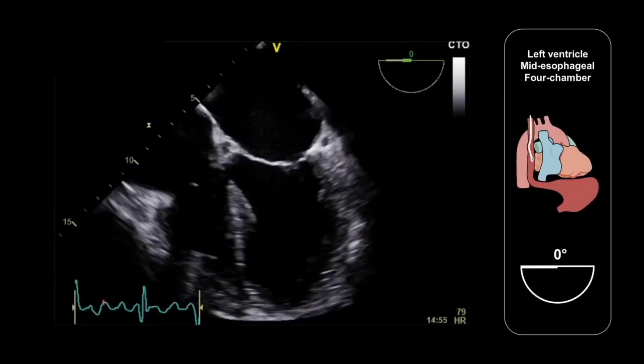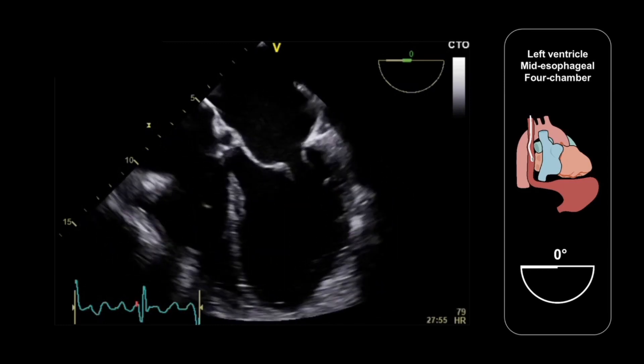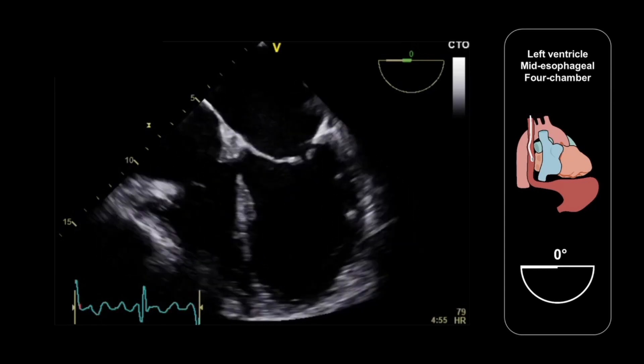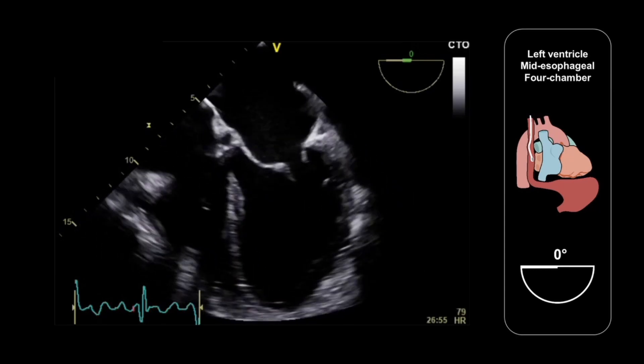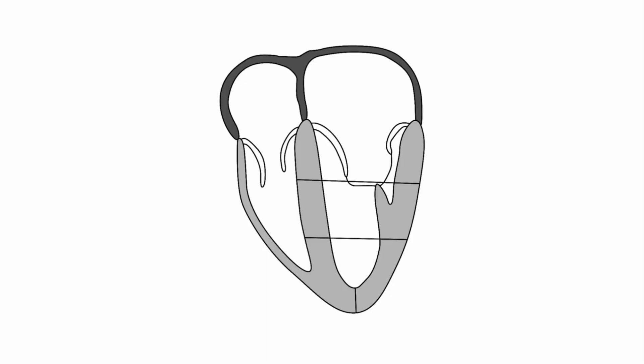In the four-chamber view, we can assess global left ventricular size and systolic function. We can also look at left ventricular wall thickness and look for morphological abnormalities, such as areas of hypertrophy consistent with hypertrophic cardiomyopathy. We can also assess regional wall motion in the myocardial segments seen in this view: the basal and mid-infero-septal segments, the apical septum, the basal and mid-anterolateral segments, and the apical lateral segment.